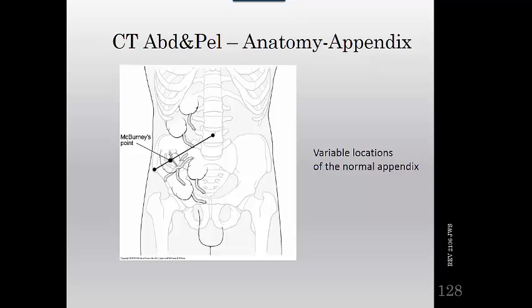This technique is often favored in patients with large body habitus because the diagnostic accuracy may be compromised in patients who have little abdominal and intrapelvic fat. So, did you notice the caveat in that statement? Thinner patients are not really viable candidates for non-contrast CT exams to diagnose appendicitis.